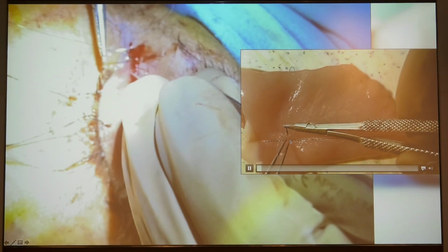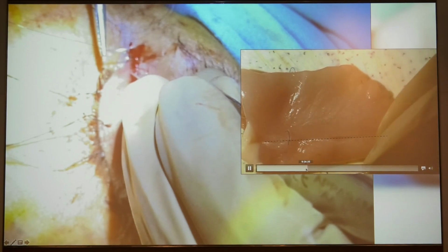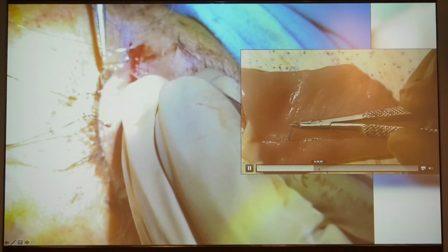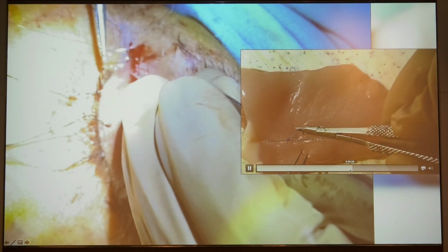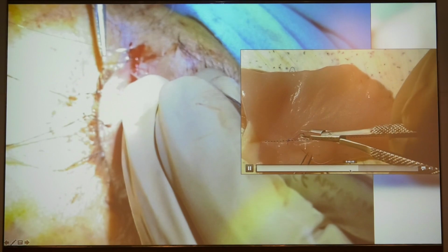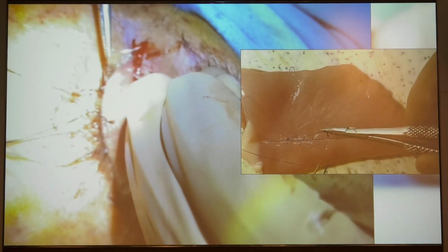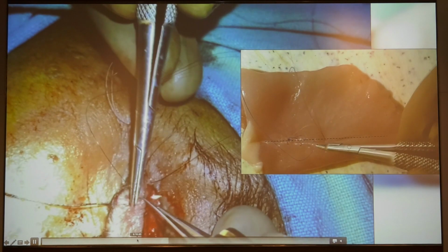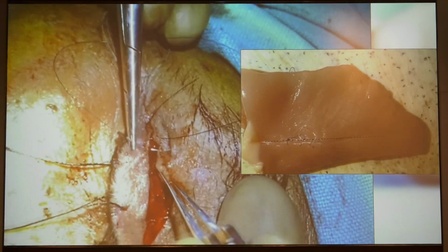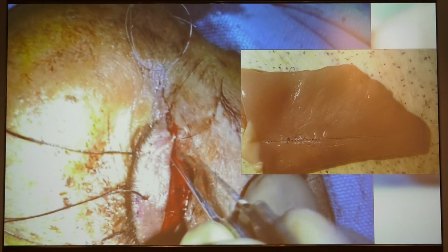Now this is for the continuous suture. So you can see it is taken at one end. It will be tied at one end, and then it is equally passed on both the sides of the incision, without passing it through the loop, so that you get continuous non-interlocking sutures. And this is an example here of when you're closing skin, you can take continuously without passing the needle through the loop. That is a continuous suture.